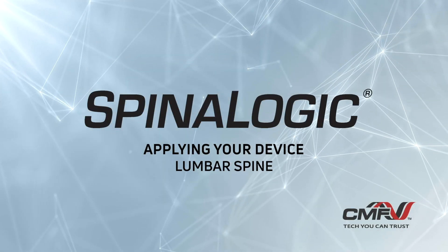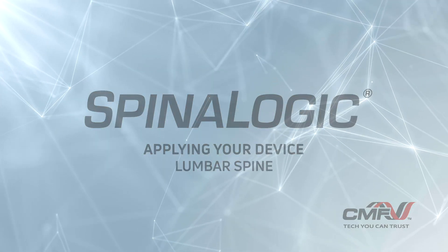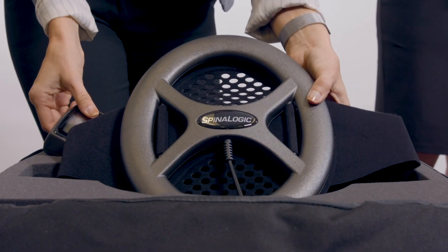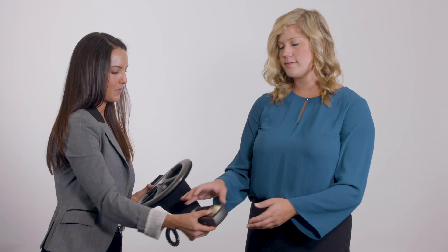Applying your device to the lumbar spine. Open your device carrying case and remove the coil along with its belt and attached control unit.